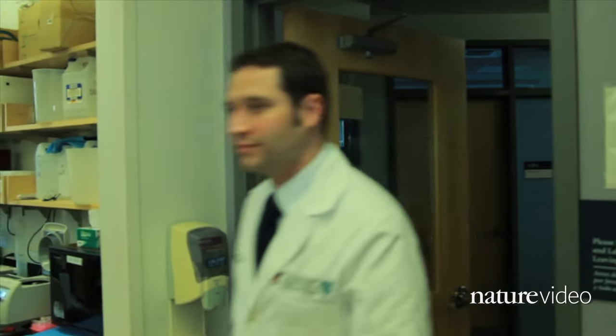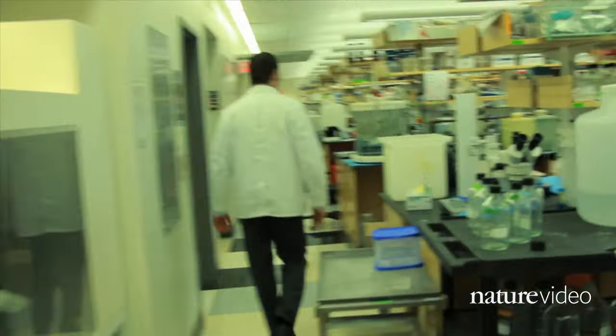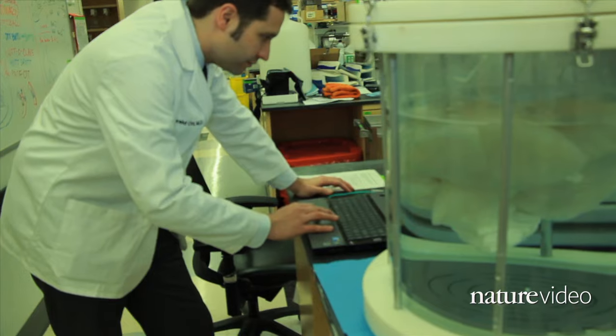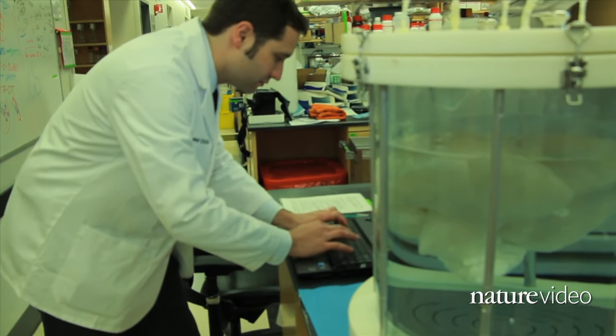Getting beating clumps of cells to organize into a three-dimensional heart requires scaffolding. At the Massachusetts General Hospital in Boston, Harold Ott and his team start with the scaffold that nature provides.